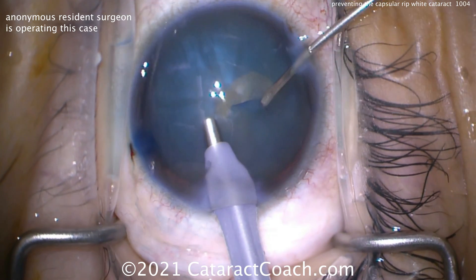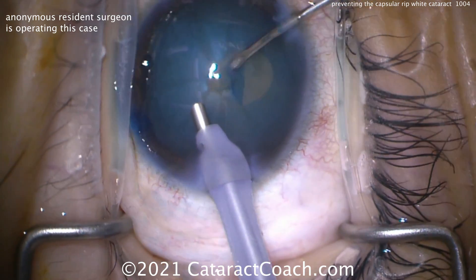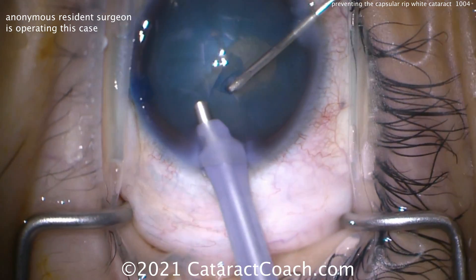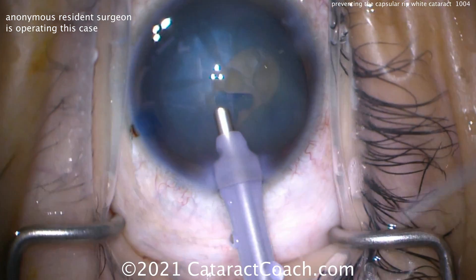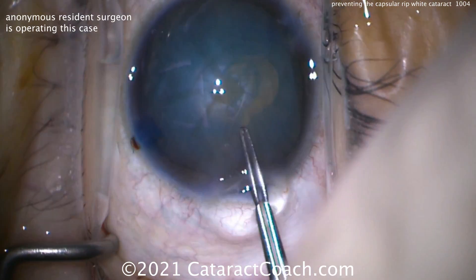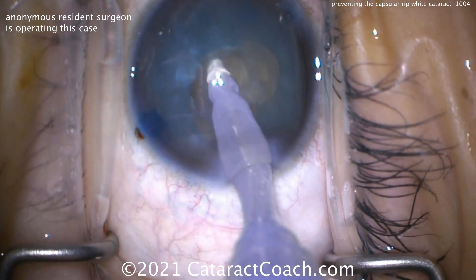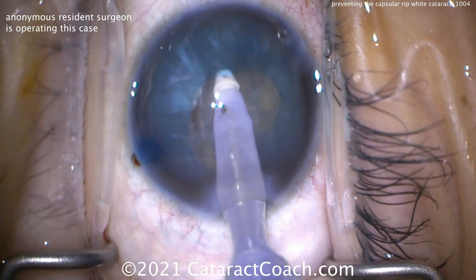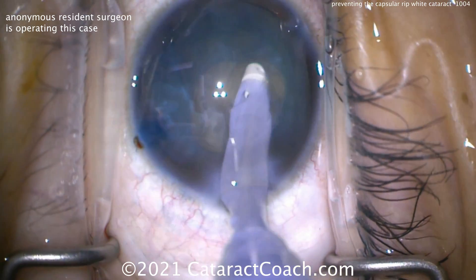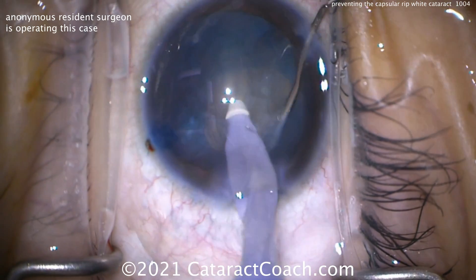With the other hand, using a cystitome through the paracentesis, we create some sort of small anterior lens capsule opening. Now this does not have to be round. It doesn't even have to be centered. All it has to be is continuous. By making it continuous, it's not going to run out towards the zonular support. Just a tiny bit left — let's get some viscoelastic in there, quickly get the forceps and pull that centrally. We did it — now we've got a kidney bean shaped opening. That's okay. As long as it's continuous and curvilinear, there are no edges that are going to run out. It doesn't have to be a perfect circle or five millimeters; it just has to be enough to be strong.